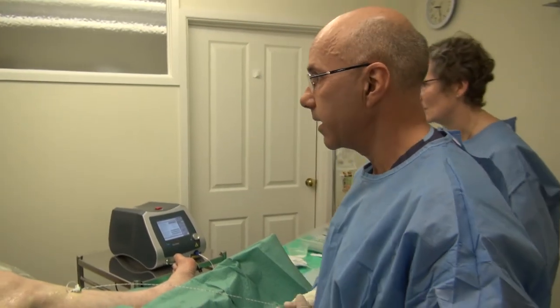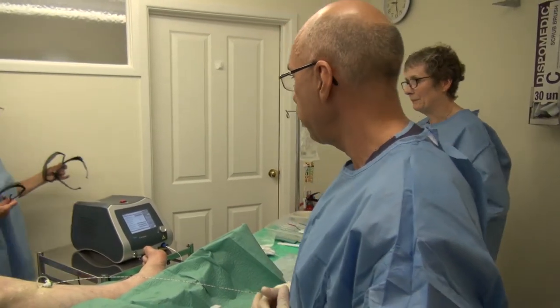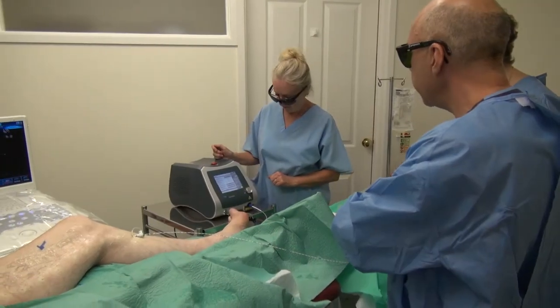Jane, who is in charge of the laser safety, is asking us to wear safety glasses. So we're going to put laser safety glasses on. Could you enable the laser, please?